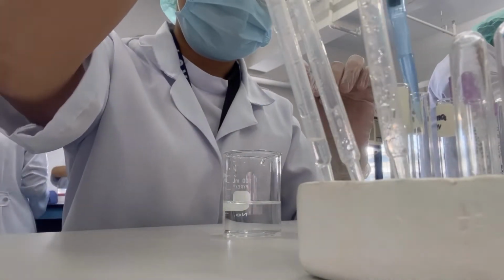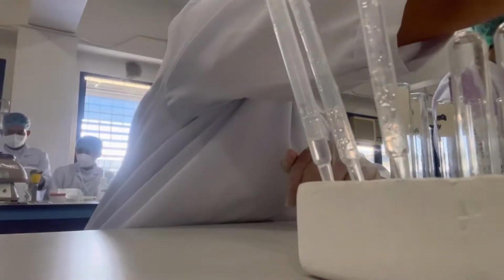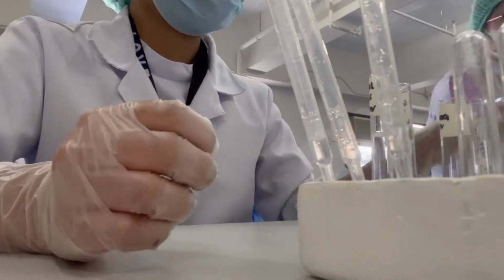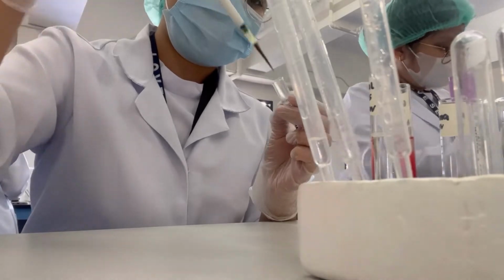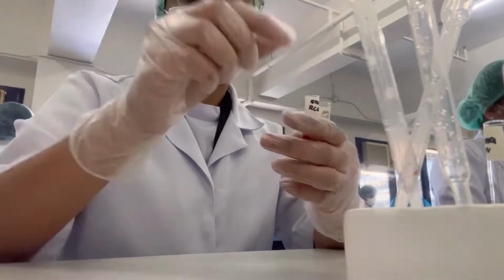To prepare a 5% red cell suspension, transfer 3,800 microliter of normal saline solution onto the test tubes. Then, transfer 200 microliter of washed red cells from the previous procedures. Then, mix it thoroughly. A proper red cell suspension has a tomato red color.